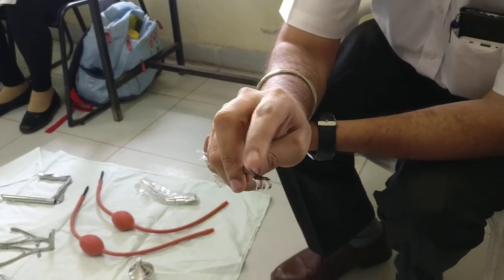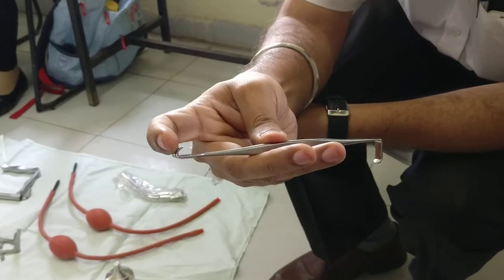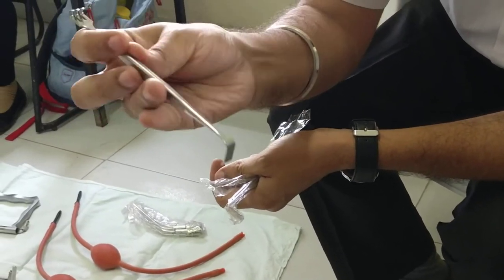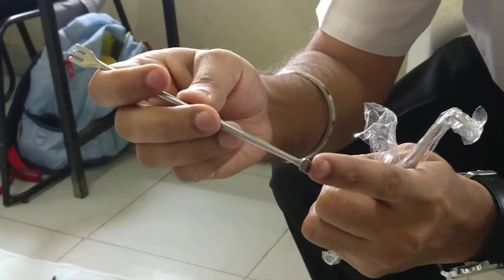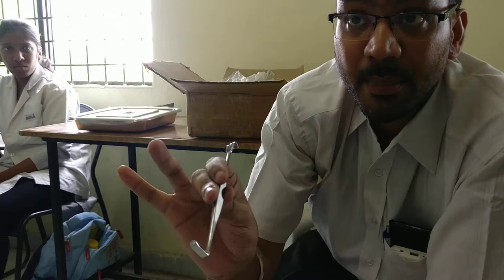The edge, one of the edges is looking like a paw of a cat. So it has got sharp prongs like this. You can put it under the skin and then pull the skin to retract. And this is something like a Langenbeck once again. You can put it here and then lift the tissues while doing the tympanoplasty.